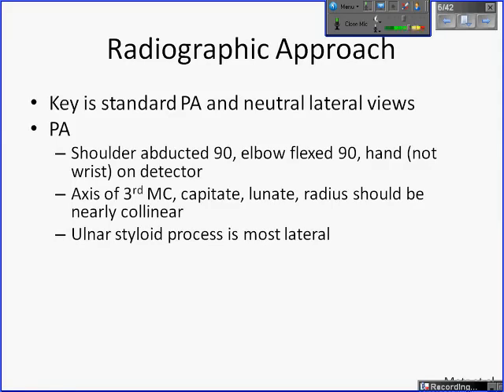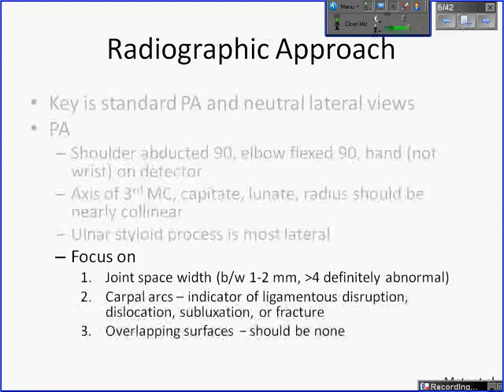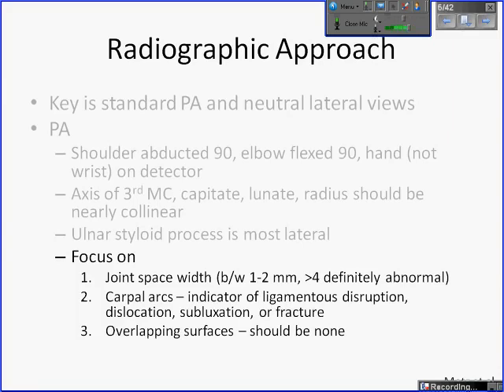For a standard PA view, the shoulder is abducted 90 degrees, the elbow is flexed 90 degrees, and the hand is rested on the plate — not the wrist. If done properly, the axis of the third metacarpal, capitate, lunate, and radius should all be roughly collinear, and the ulnar styloid should be the most lateral aspect. On every PA wrist, joint spacing should be uniform at roughly 1 to 2 millimeters — greater than 4 millimeters is definitely abnormal. The carpal arcs should always be examined; any disruption indicates ligamentous disruption, dislocation, subluxation, or fracture. Any overlapping surfaces are also abnormal on a properly performed PA.